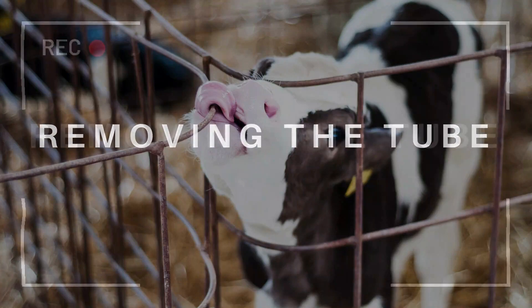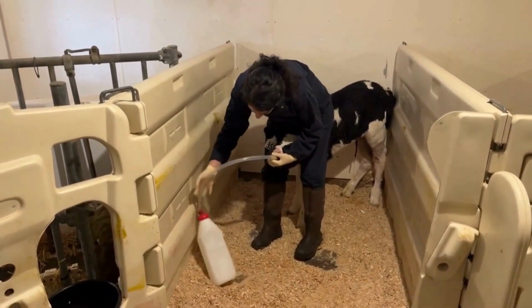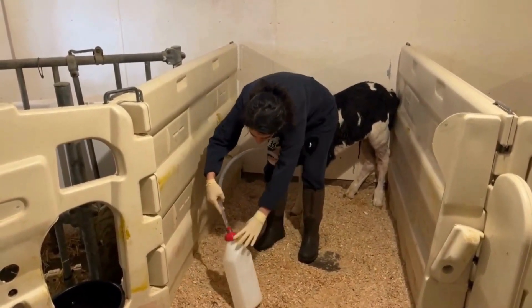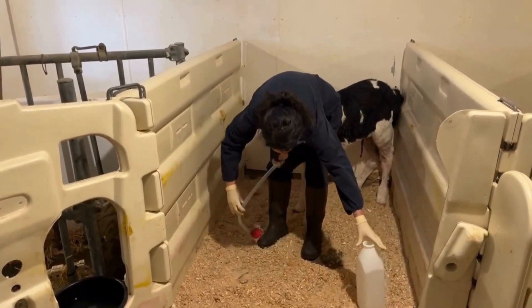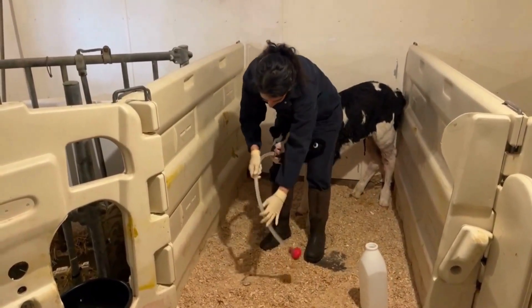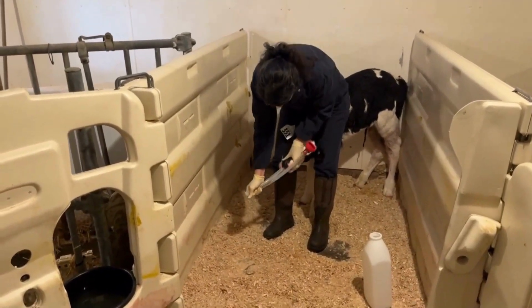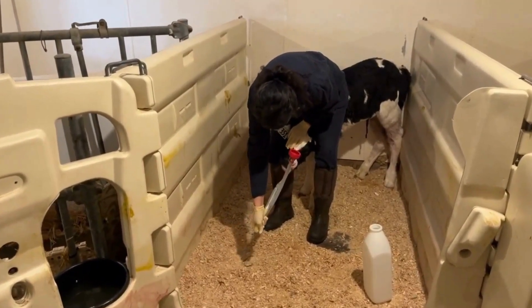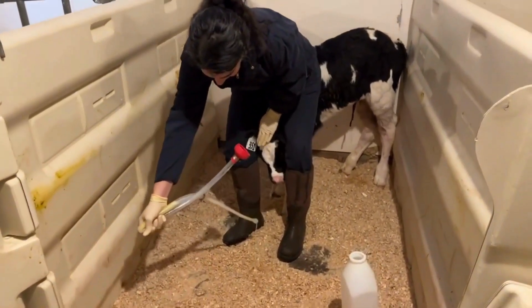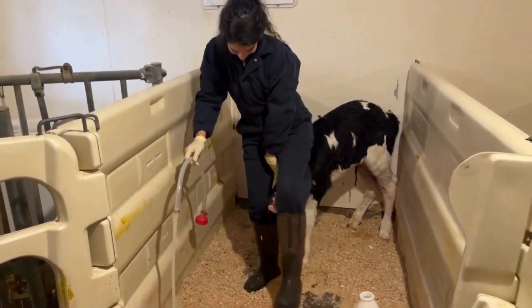Never remove the tube while there is fluid flow. To stop the flow and avoid fluid aspiration, crimp or bend the tube. Once all the fluid has passed down, bend the feeding tube before pulling it out. Make sure that the tube and flexible tube connected to it are empty before removing it. Lower the head of the calf and slowly remove the tube towards the ground to avoid fluid aspiration.